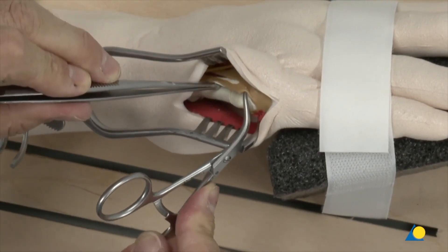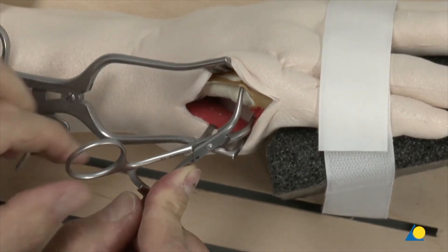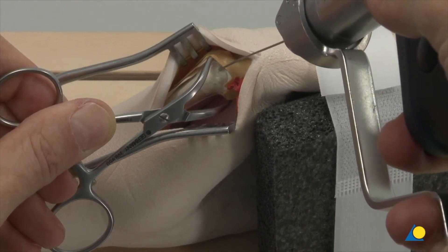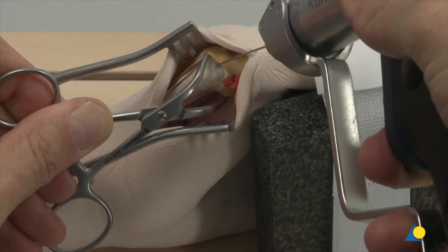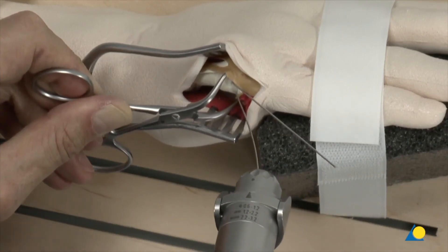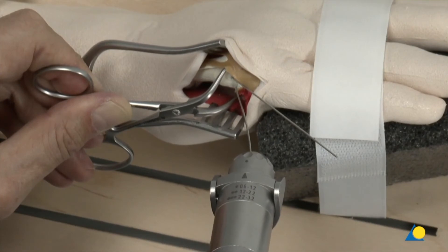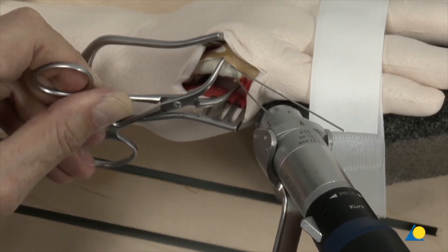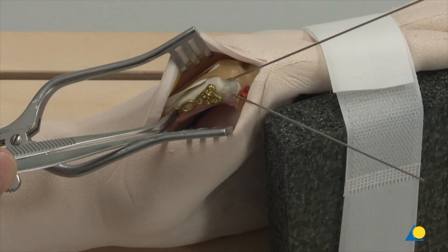Open reduction is performed and two 1.0 mm K-wires are inserted distal to the intended plate position. The plate is situated on the ulnar side of the fifth metacarpal so that its position does not interfere with extensor tendon gliding and respects the ulnar collateral ligament. At least two screws must be used to stabilize the head fragment.